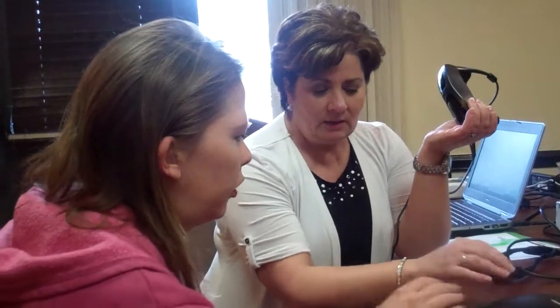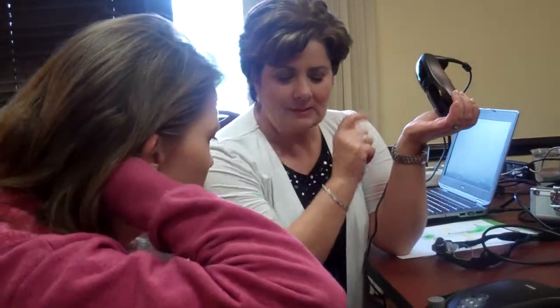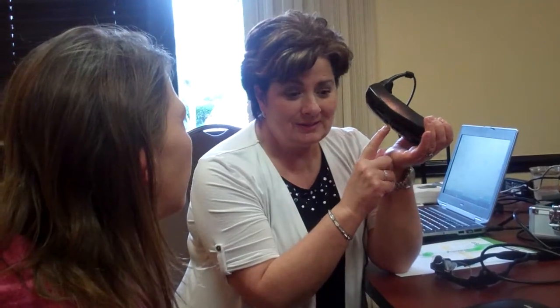And then in the middle we have a track pad, and you can feel that, Jessica, because in the middle you feel that little raised dot. That gives you your center orientation to four arrows, which are north, south, east, and west. It also has another function as well, and that's the freeze function. So this is a camera, right? Yeah, so you can take pictures.